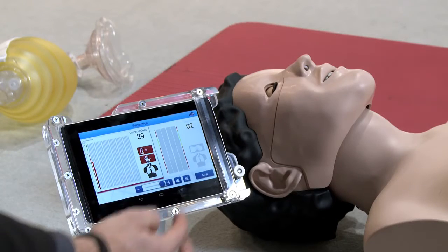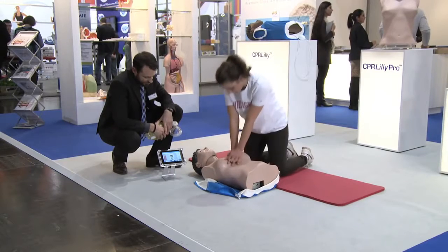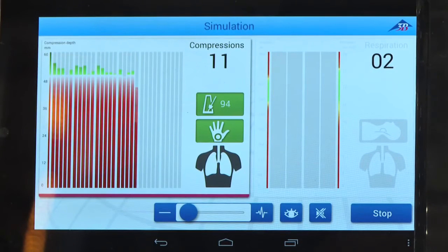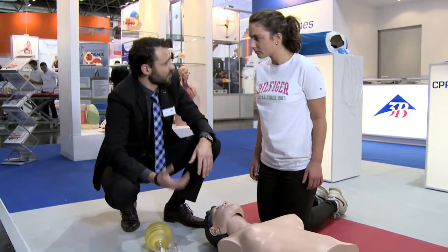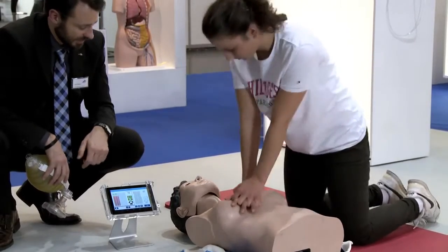Eye opening and carotid pulse can be controlled via the tablet. In addition, the tablet will give you immediate feedback about the accuracy of the chest compressions and ventilation. The tablet will also indicate the volume and speed of ventilation. This immediate and accurate feedback will guarantee a unique efficiency in CPR training. The CPR Lily Pro is supplied with a tablet.